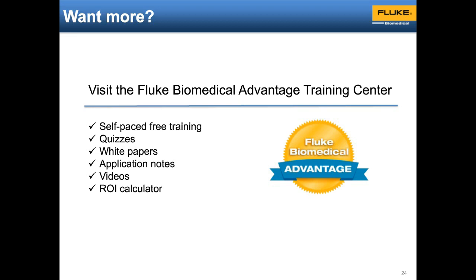Okay, and how do I develop a test procedure for testing SpO2 sensors? Could you repeat that? How do I develop a test procedure for testing SpO2 sensors? Yeah, sure. So the first place to start is with the manufacturer service manual. That's the place where all of the service conditions should be outlined from the manufacturer. You can also look at Toby Clark's MDQA book as a reference.